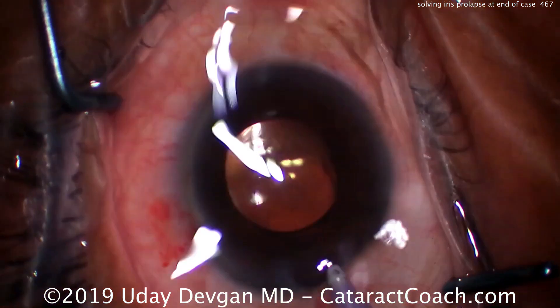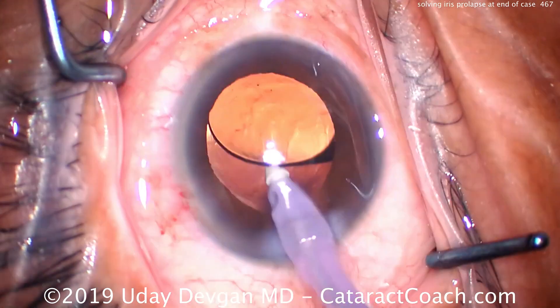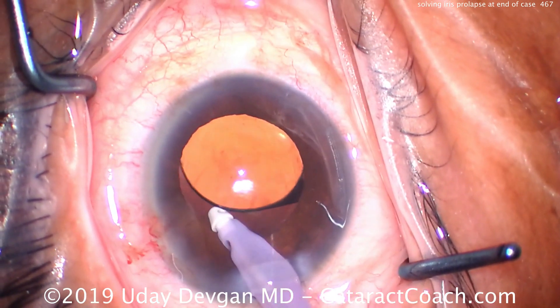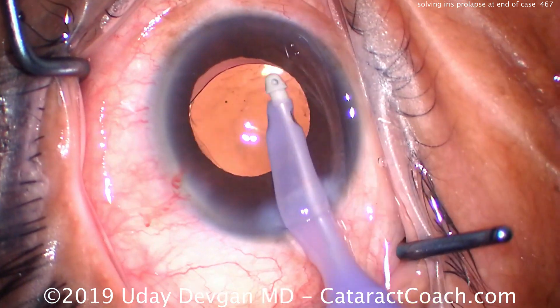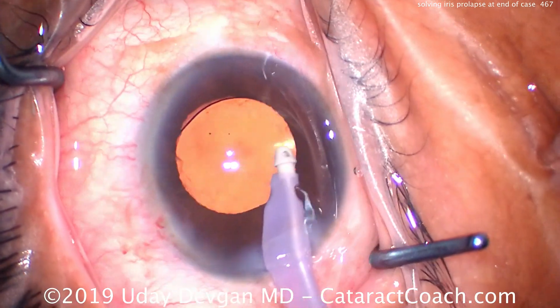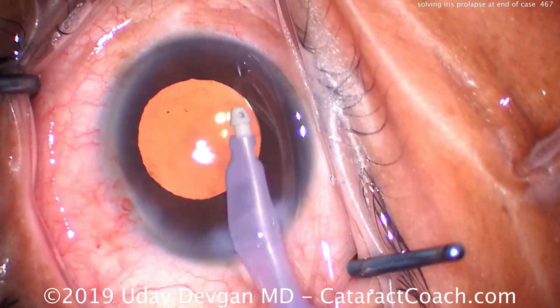Rotating the lens, getting it to unfold — haptics are straightened out. Again there's iris prolapse. So let's get the viscoelastic out of the eye: put the probe in here, avoid touching the iris, clean out all the viscoelastic, go behind the IOL optic like this, and clean out all the viscoelastic from the front part of the eye.